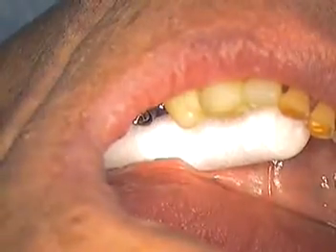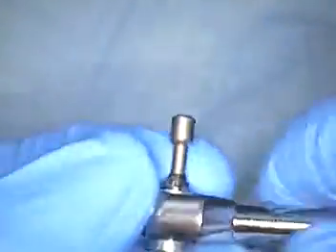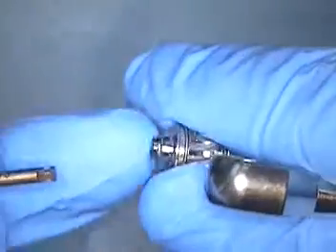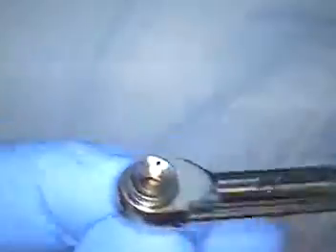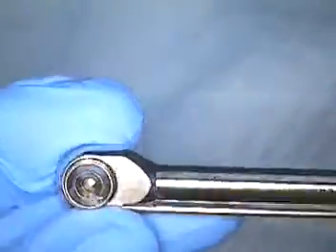Now we're going to go on top. Change our drivers now. We're going to move now toward an internal hex. So this is an external hex driver. To pop that one out. Just separate that. I like this driver from Nobel because it takes these right angle end drivers and locks them into a chuck. A simple ratchet for those who are used to using ratchets on automobiles or anything. These are the same concept.